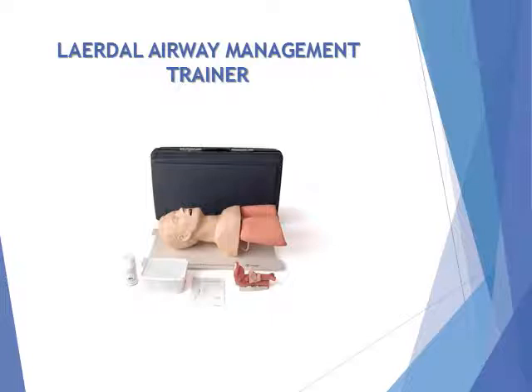Practical training in clearing unobstructed airway and suctioning of liquid foreign matter. Minimal maintenance and robust design delivers cost-effective training. Base plate mount allows stable practicing conditions. A hard carry case provides easy transportation and safe storage.